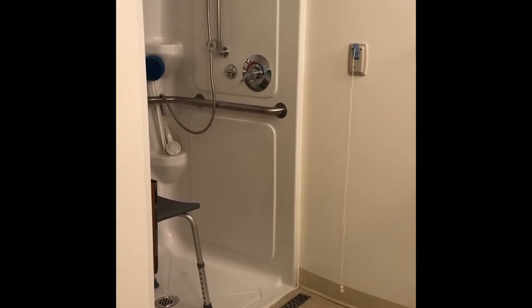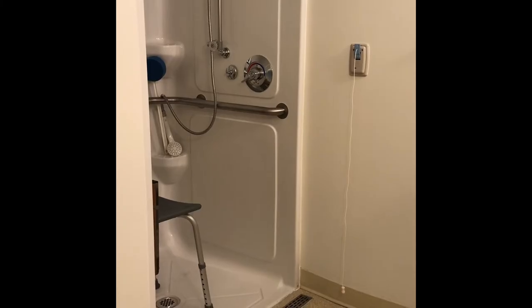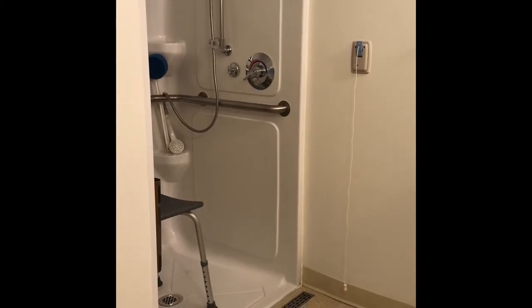Turn on a fan or keep the door open to keep your bathroom well ventilated. Use lukewarm water to avoid overheating or making yourself too tired.